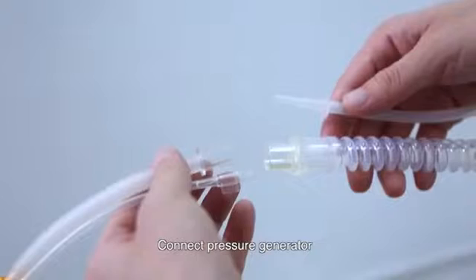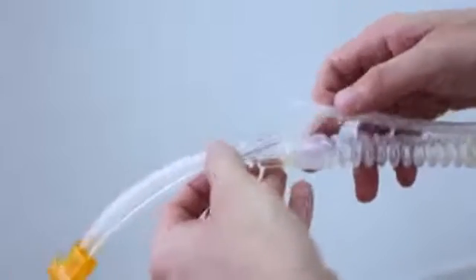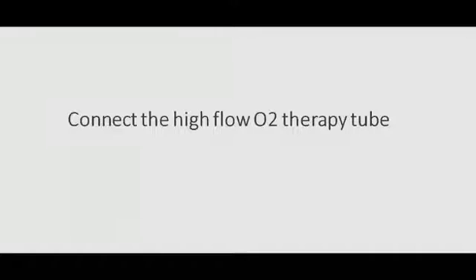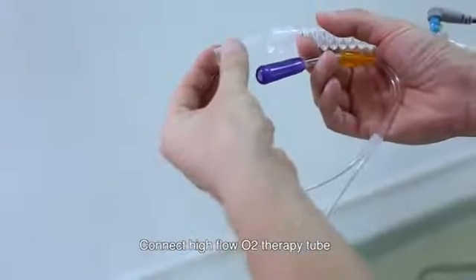Connect the pressure generator. Connect the high-flow oxygen therapy tube.